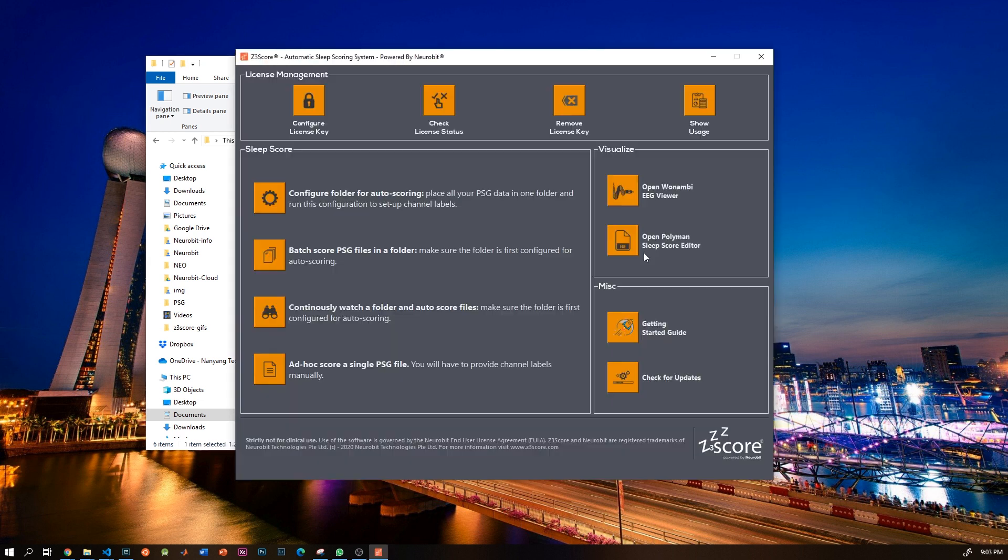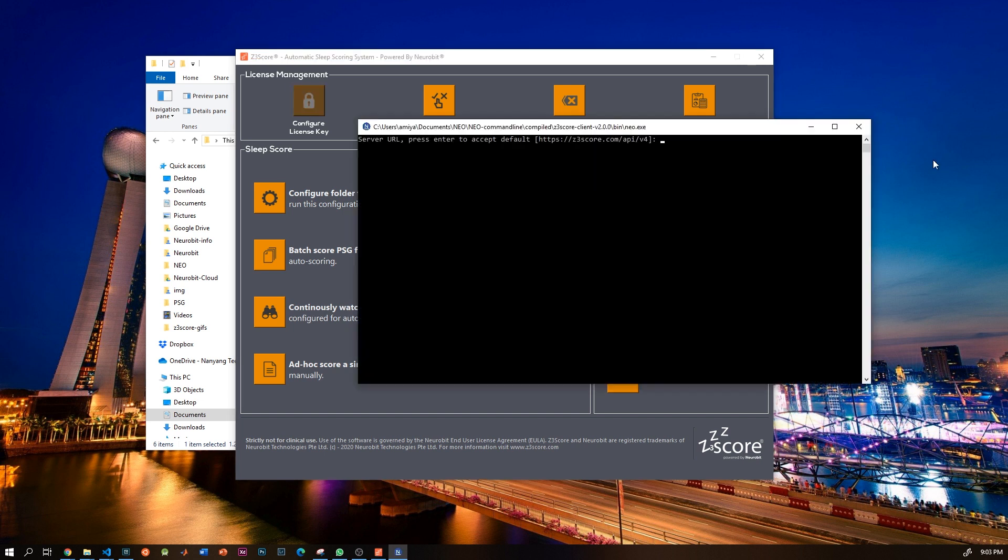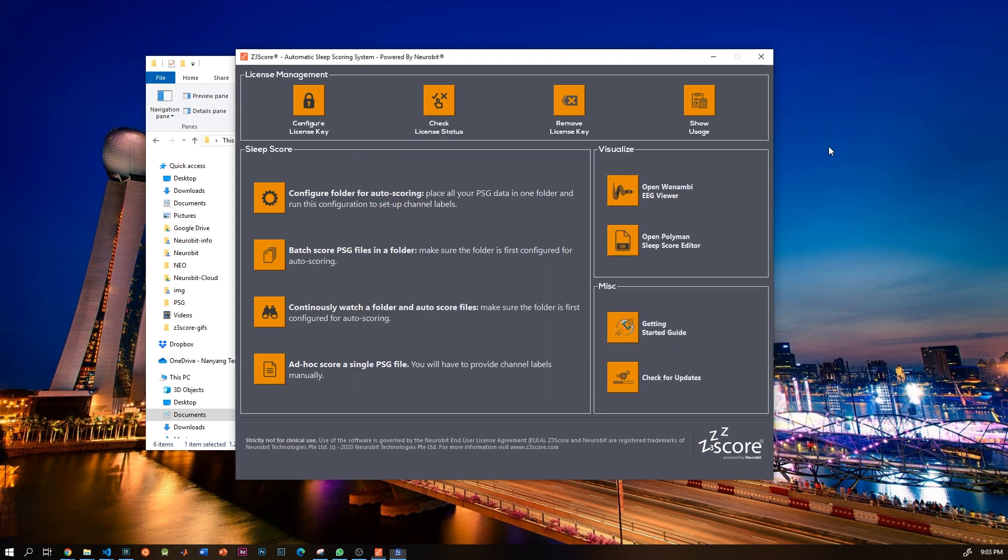Click on z3score to start. First thing you have to do is set up the licensing. Press configure license key, which will open a new window. You don't have to change the server URL, so just press enter, and then enter your email address and your license and you are done.